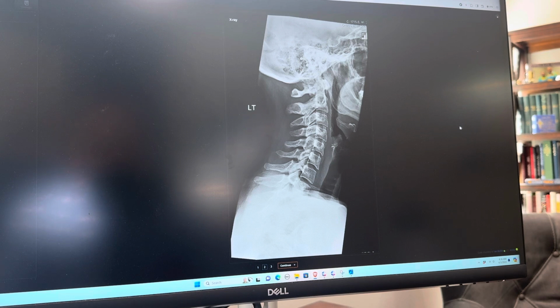I don't need you to know how to read an entire X-ray series. I don't need you to know what we're looking for and what's happening. I just want you to be able to visually take a moment to look at a photo, appreciate it for what it is, and then work through understanding what we're talking about when we see normal versus abnormal.